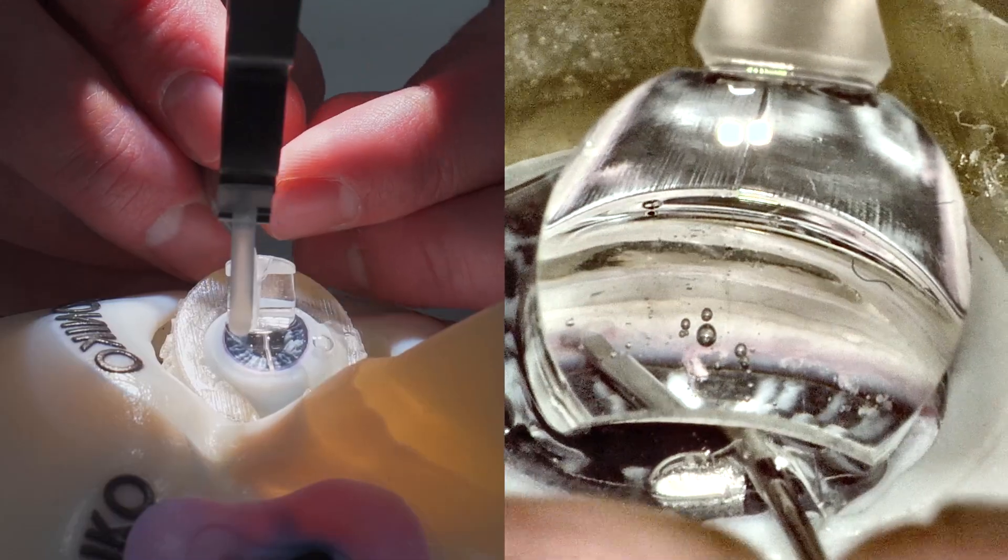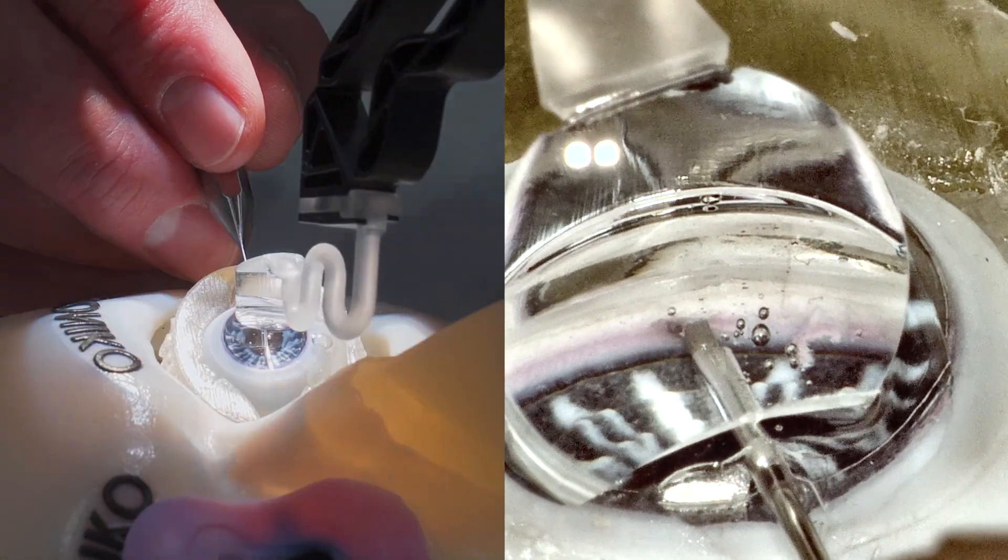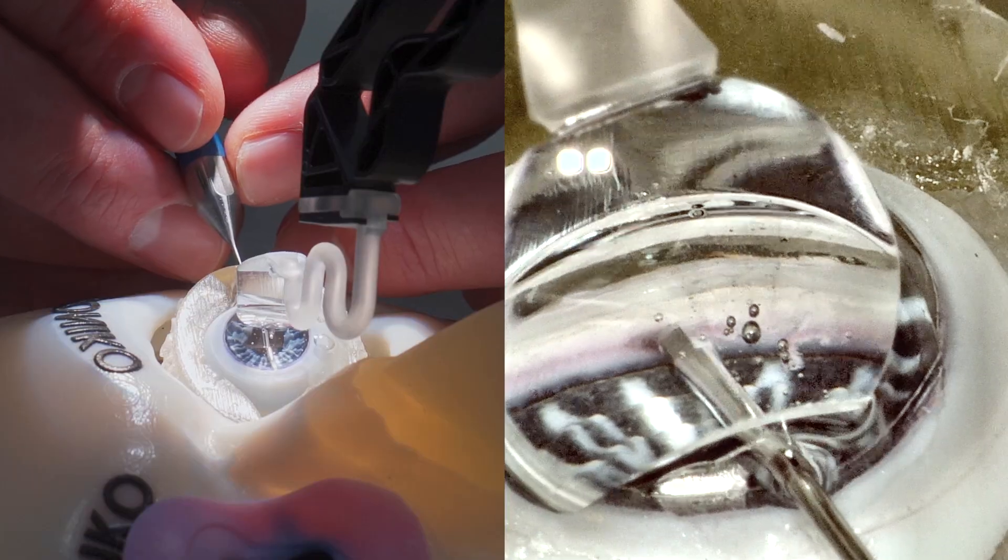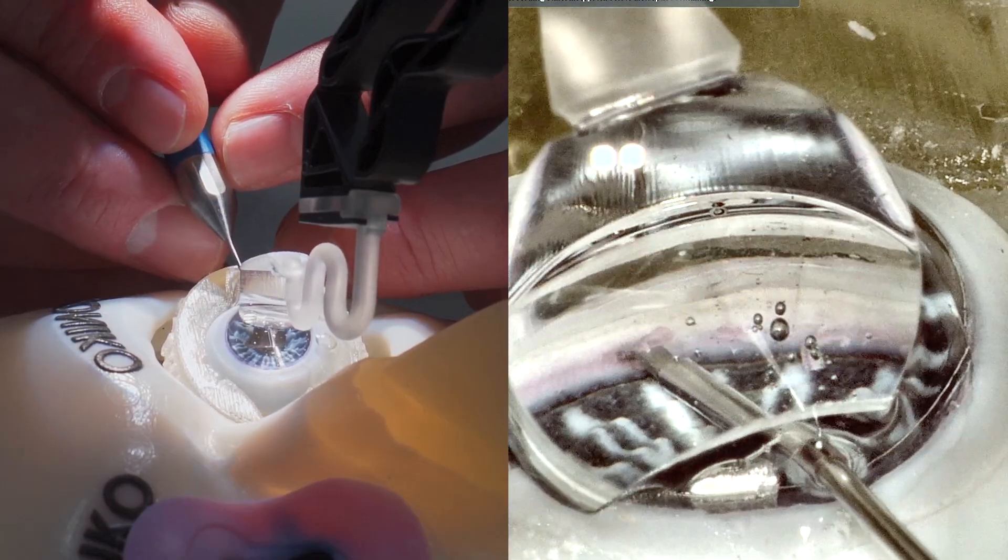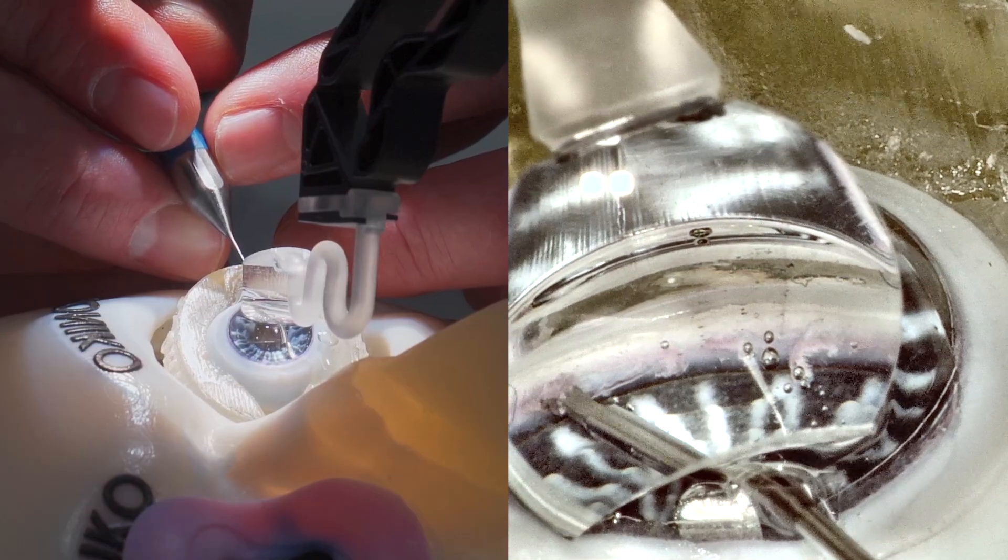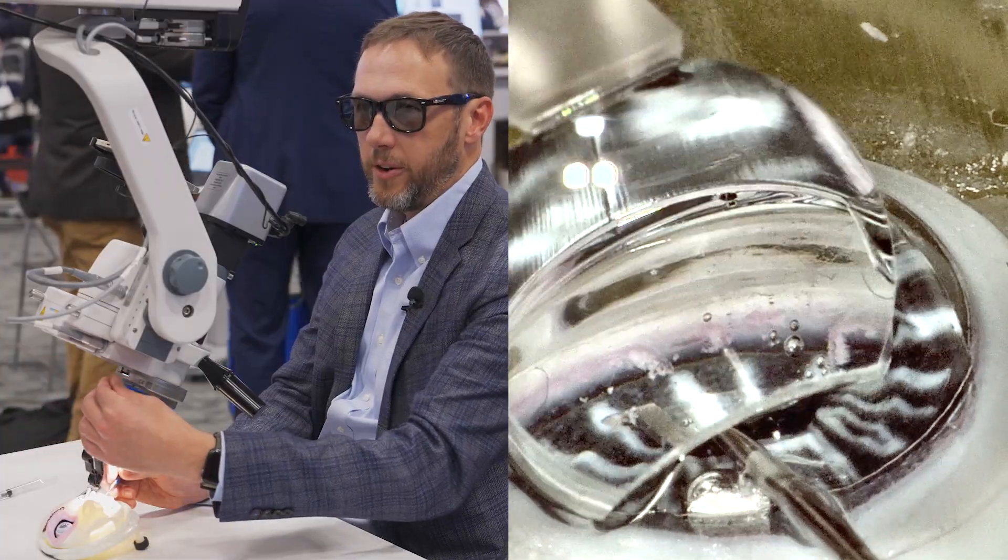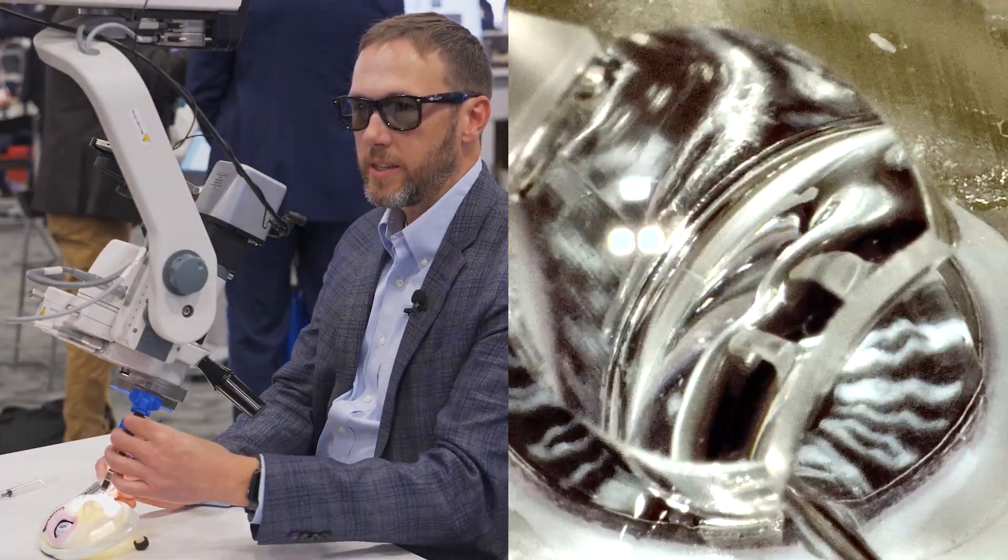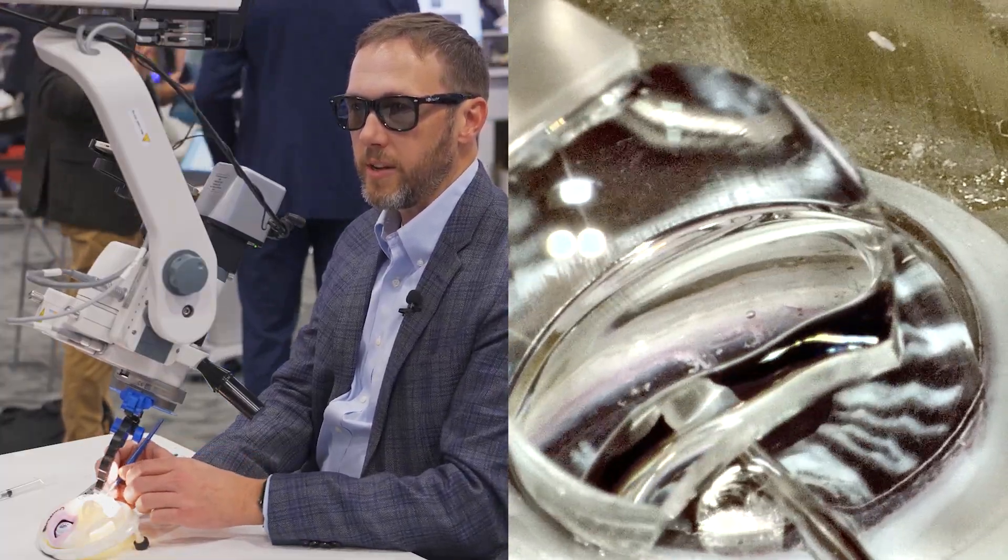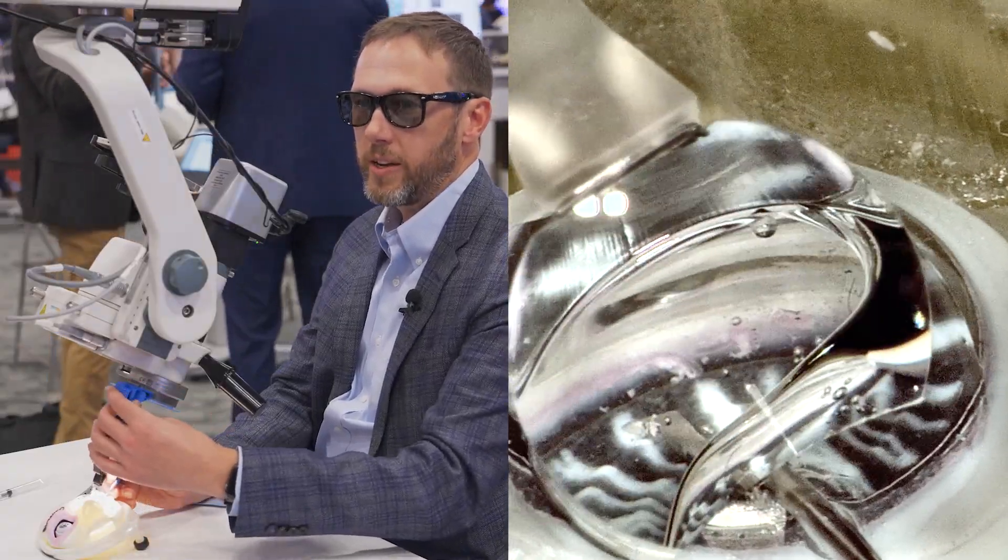As I go to the side here, you also have the opportunity to swing the gonio to your left, just like you would with the Swan-Jacobs lens. You can swing it to the left—there's actually two preset positions. We're going to go a little bit more with the forehand here. If we want to get a little bit further, I can go another click to the side. Now there we lost focus—that's okay, we'll just readjust. Again with the foot pedal, make sure we get a good seal back here.